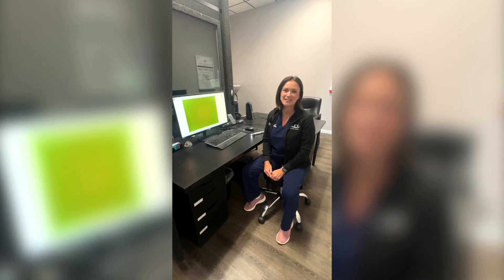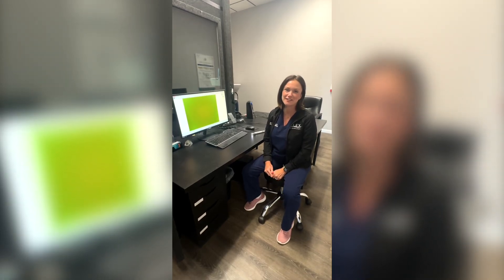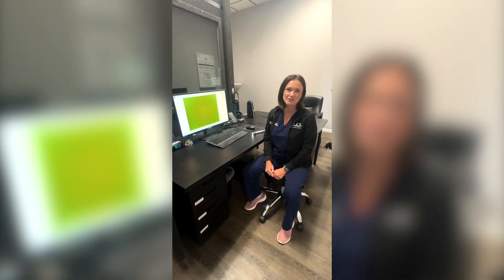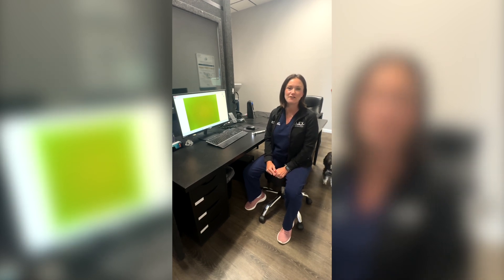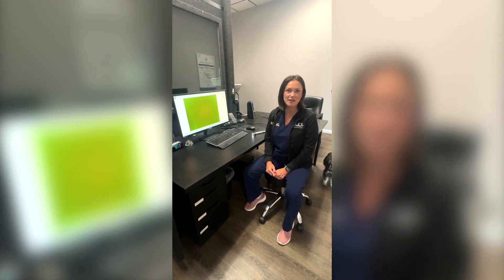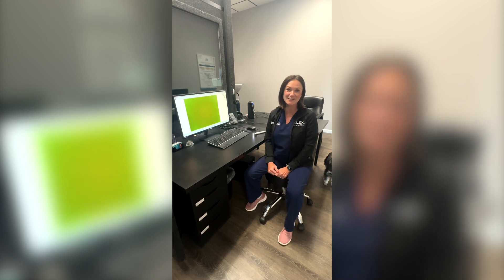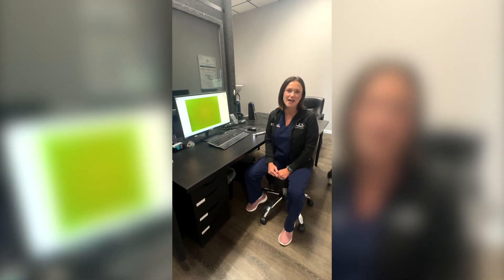Hi everyone and welcome to an episode of the Flex Audiology show. My name is Dr. Erica Person and today we're going to talk about video otoscopy. I'm actually going to show you my ear on the screen and what we look for when we do that.